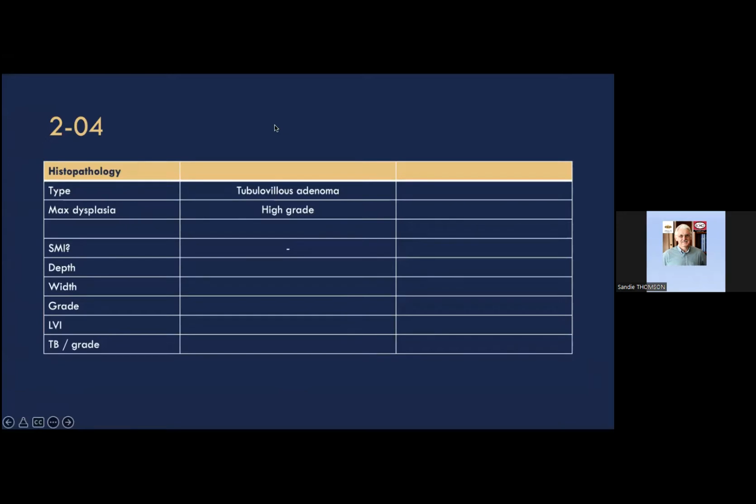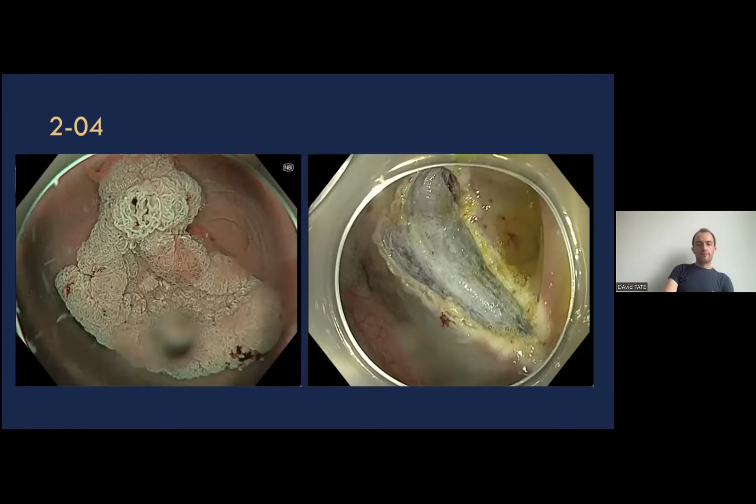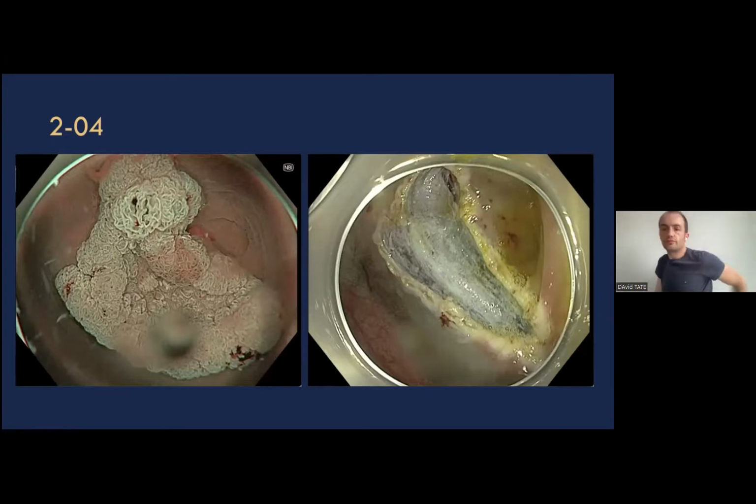I see you use quite a bit of water and you use the cap. Traditionally in South Africa, as far as I'm aware, most people don't use the cap for diagnostic colonoscopy. So when do you use it routinely? And we noticed that obviously it does help very much with near focus and with water immersing the lesion. Is that also part of your assessment of these polyps? So is it routine? When do you put it on?